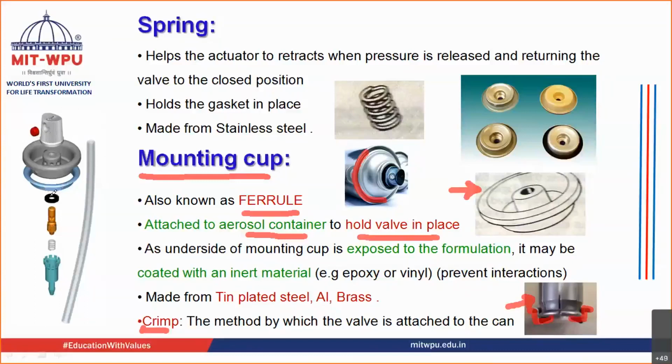One more thing that you have to remember is that the actuator is not in contact with the product. The spring and the stem are present inside the housing.